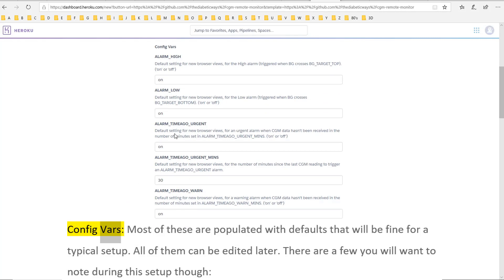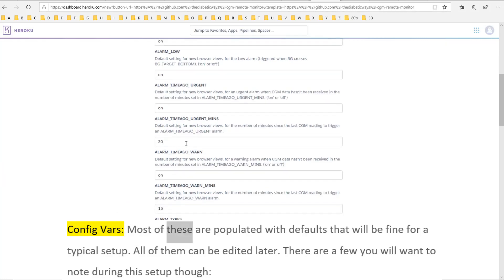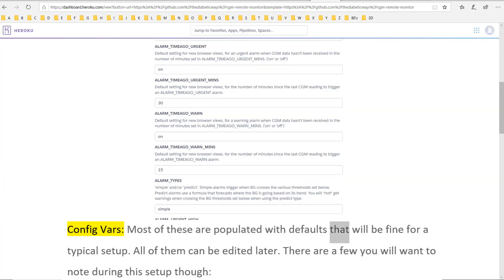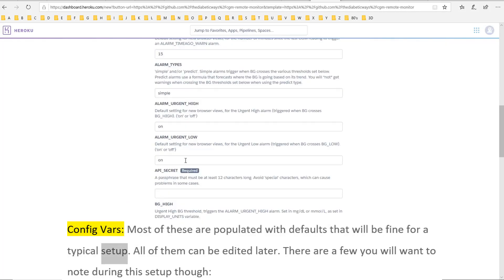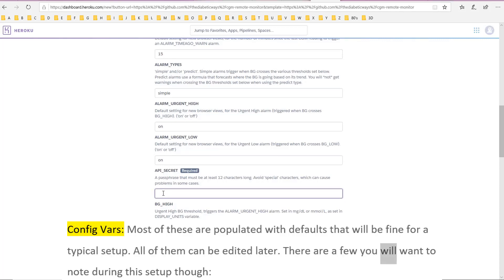Config vars: most of these are populated with defaults that will be fine for a typical setup. All of them can be edited later. There are a few you will want to note during this setup though.